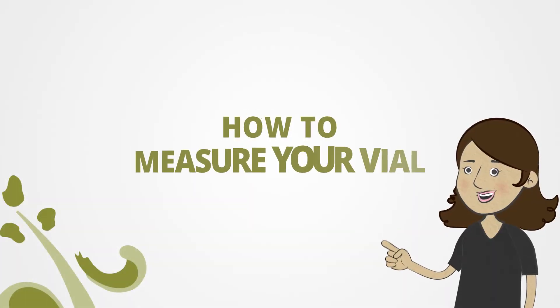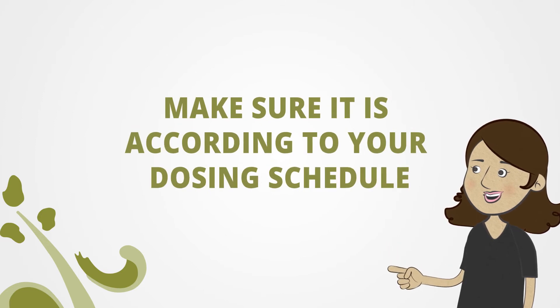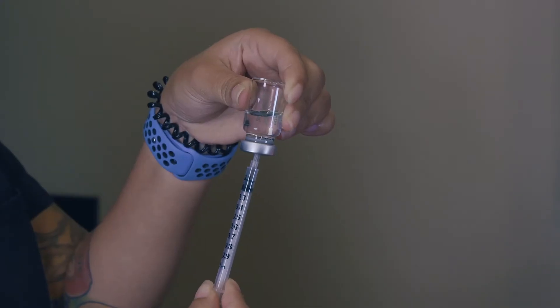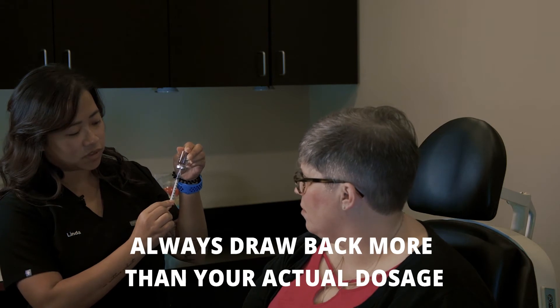Next, I will show you how to measure your vial. First, you will have to make sure it is according to your dosing schedule. You're going to hold your vial upside down. So let's say we are doing 0.05 today — you always want to draw back more than your actual dosage.